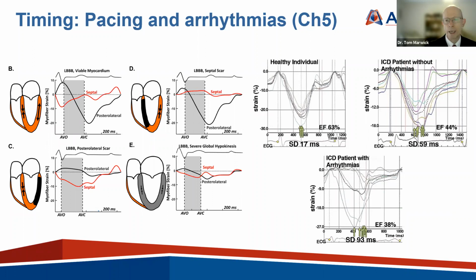The group in Norway have been leaders in this. I think measuring timing is less robust than measuring actual magnitude of strain or patterns of strain, but there's a significant amount of data about this, and it is an interesting application. So I think it's an area that we'll see more of. Next slide, please, Christina.